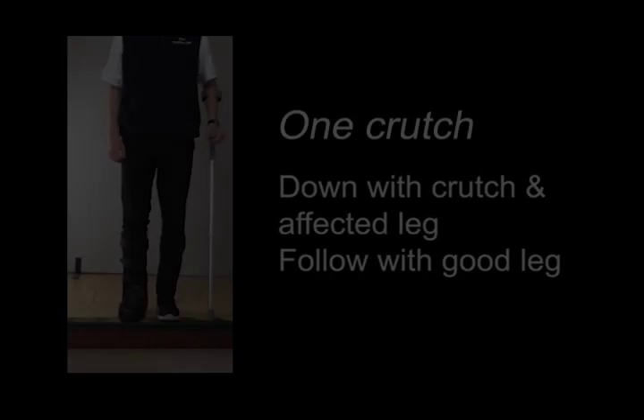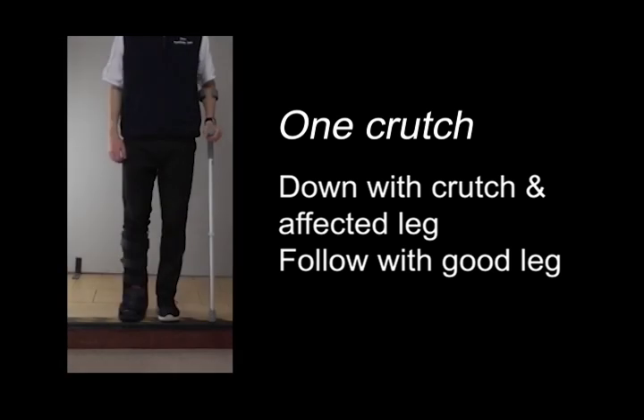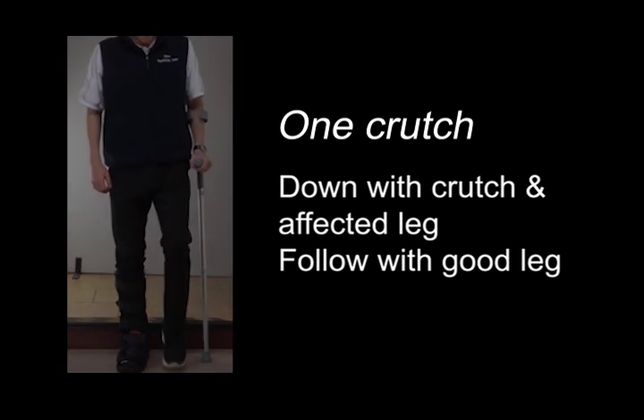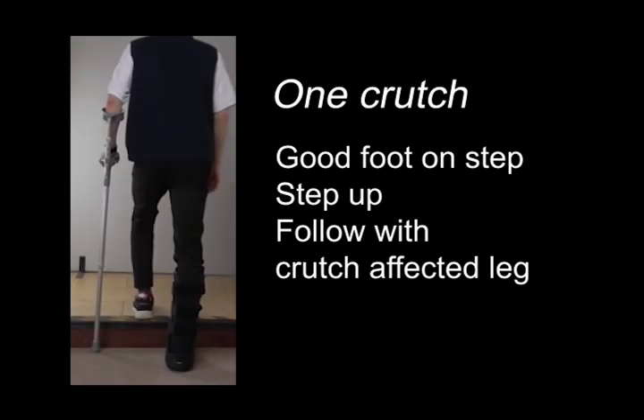The same thing applies when you walk up and down stairs with only one crutch. Just remember to place it in the opposite hand to your affected leg. This takes your body weight away from the leg and towards the crutch.